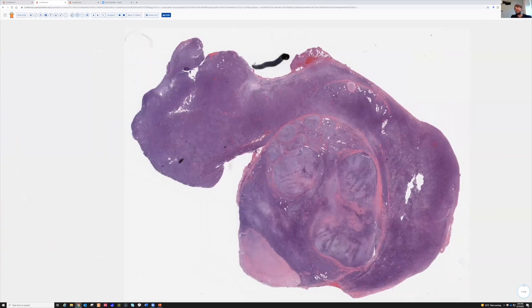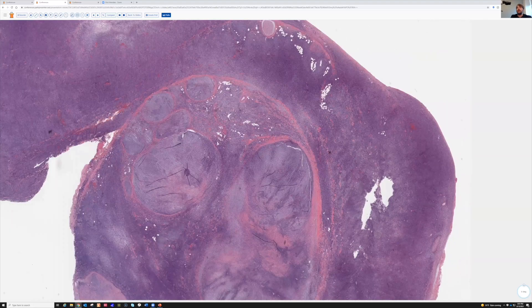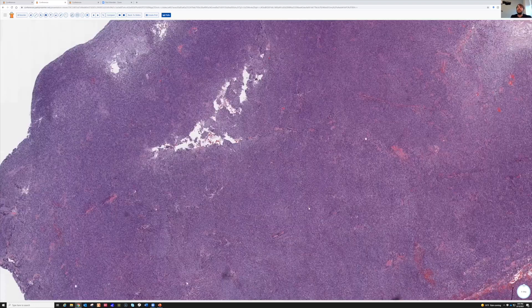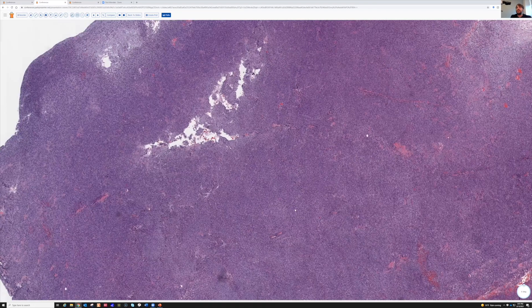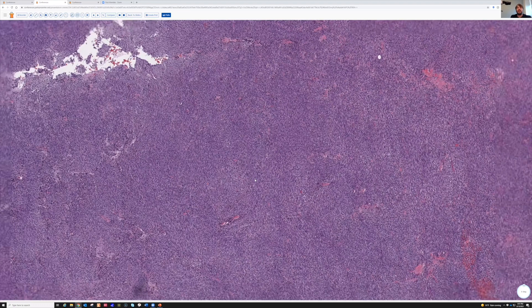Here we have a mass from a 25-year-old patient in their arm. It's very blue and cellular, with fascicles of spindle cells and areas of herringbone pattern. It looks quite a lot like the synovial sarcoma I just showed you, at least in this area.